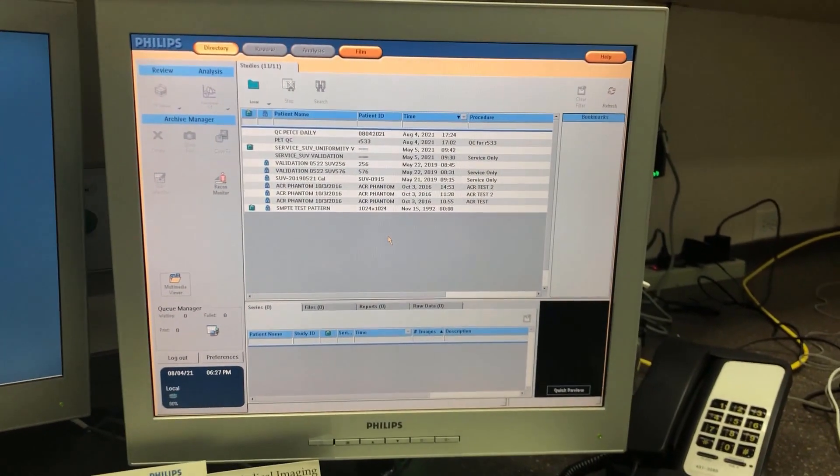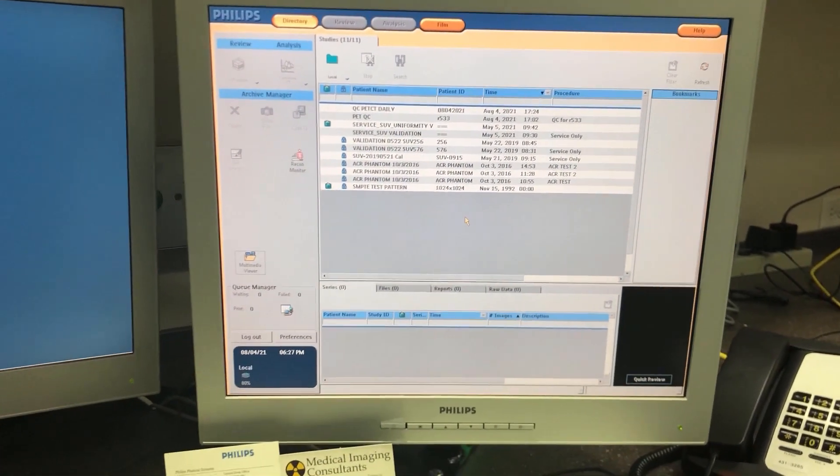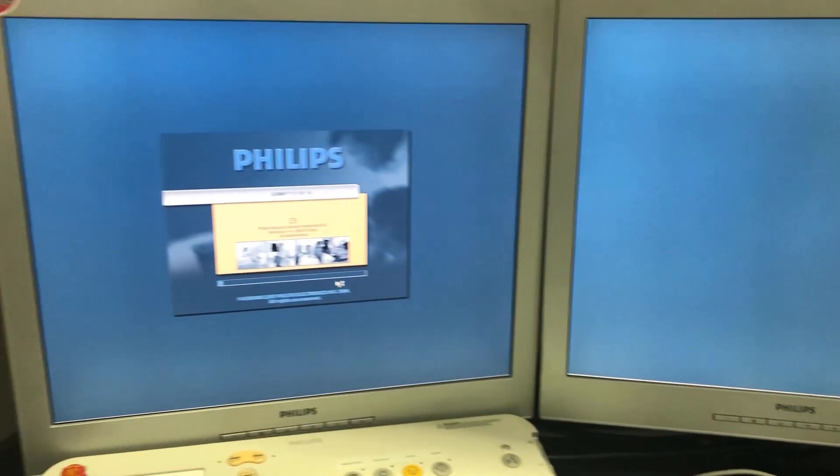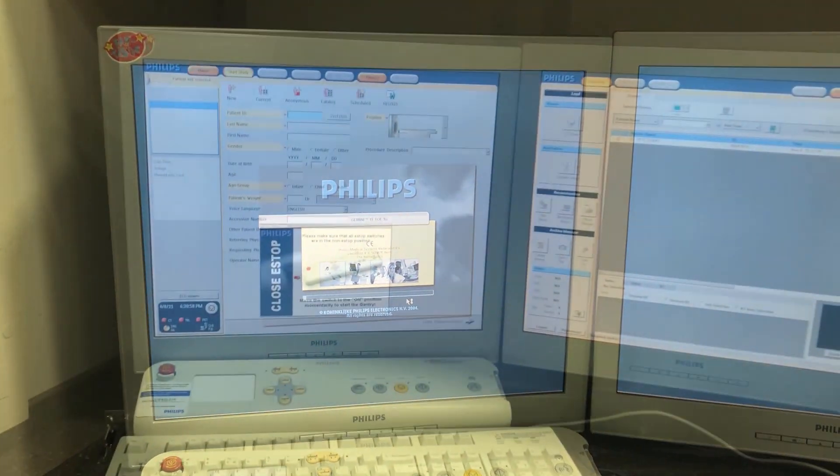You're just going to click on okay or yes. And the pet CT host came all the way up. And now we're just waiting for the CT host.